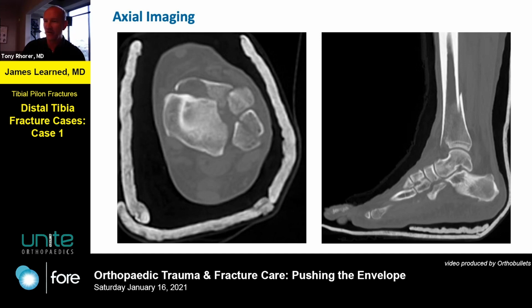You're never going to get it all the way down, because you're going to get some stretching through the ligaments and stuff like that, but you'll help yourself tremendously. And the fact that you got such a gorgeous reduction on that with your screw, which, I don't know if people realize this, was posterior to anterior. I want to ask you how you did that, because obviously your incision wasn't posterior.